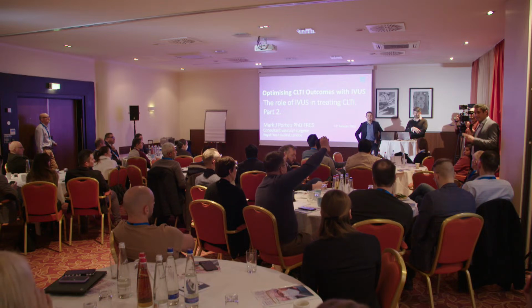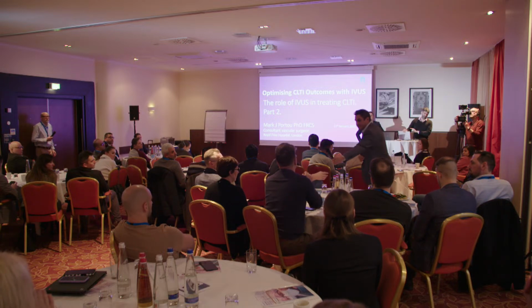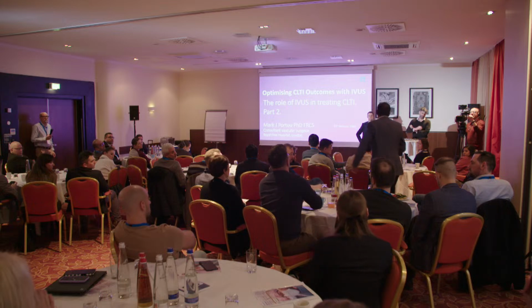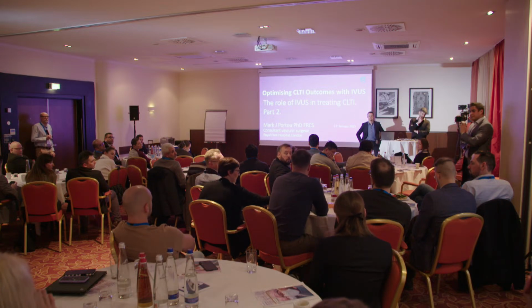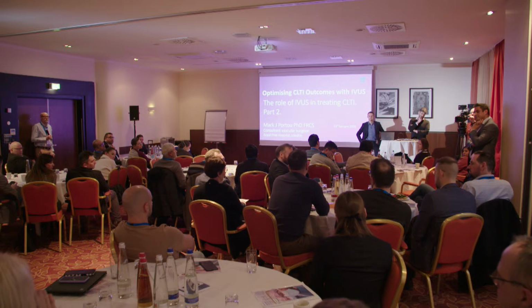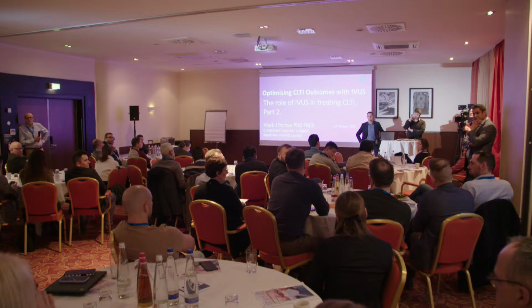Any other questions? Yeah, you talk a lot about selecting the proper equipment for vessel prep and also sizing. In our service, most of the time we have CTA done previously, so we lean on that a lot when we make decisions about sizing and what kind of equipment we use. So if you take that into account, what are the main benefits of the IVUS in these cases?